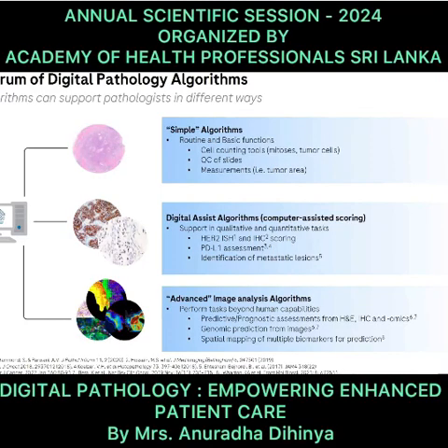Those 12 antibodies have been run on the same slide, and very soon in the future we'll be seeing those kinds of features available. So multiplex algorithms are also in the future pipelines, and many AI companies are developing them.